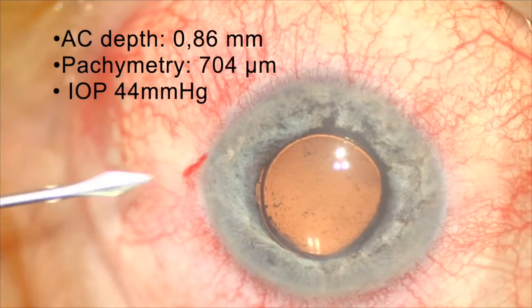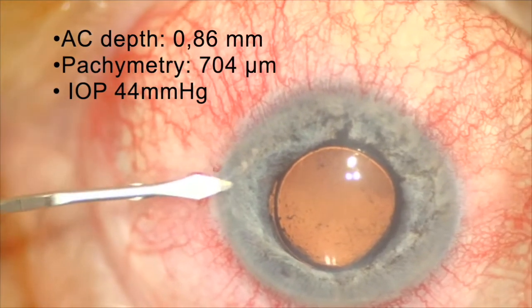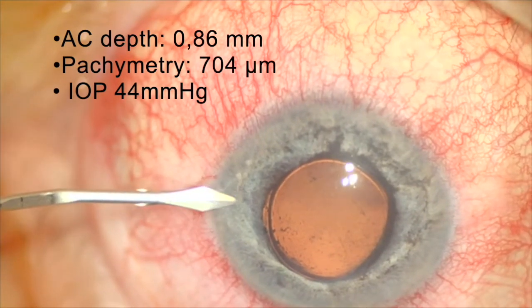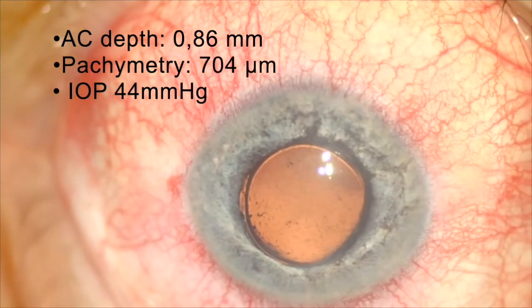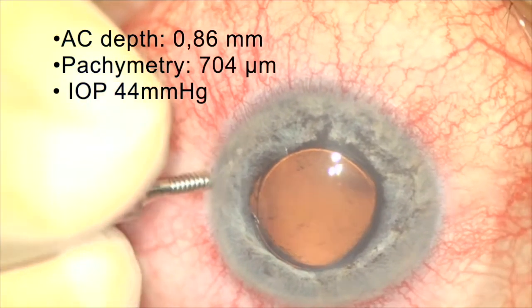Good morning everybody, good morning from Humanitas Castelli. Today we are doing surgery for iridocapsulozonovitrectomy. The patient has been already operated for retinal detachment and tamponated with silicone oil.